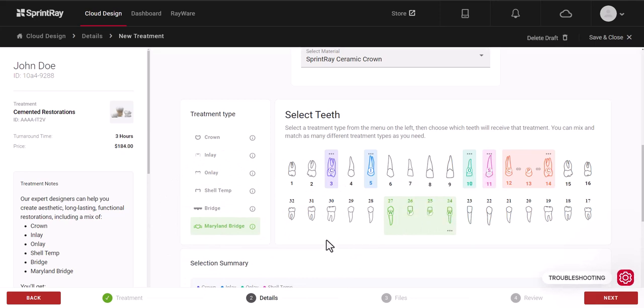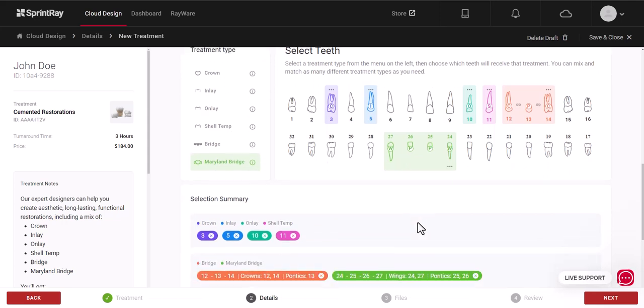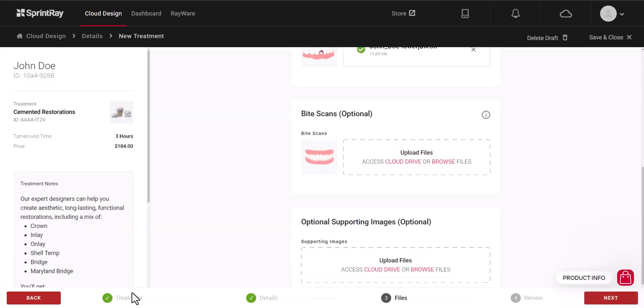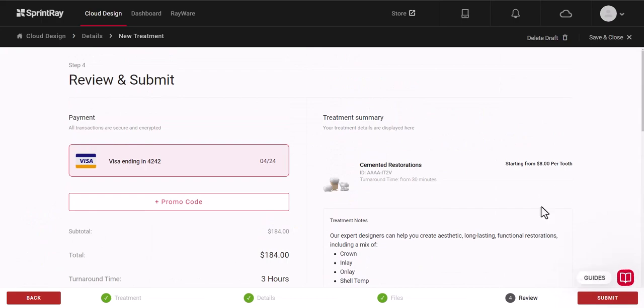At any time you can hover over the useful tooltips to get more information about that particular design. Input any additional notes for the treatment plan for the designer, then upload your scans, and once complete submit your design.